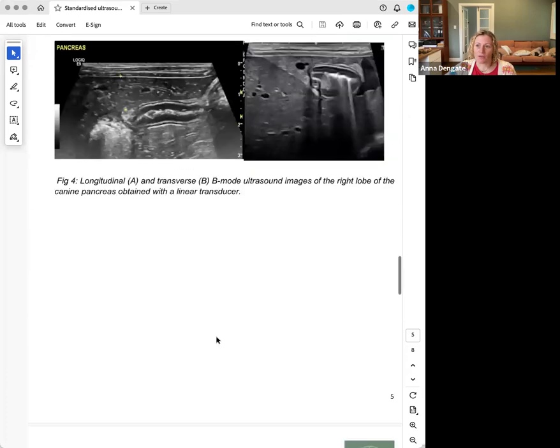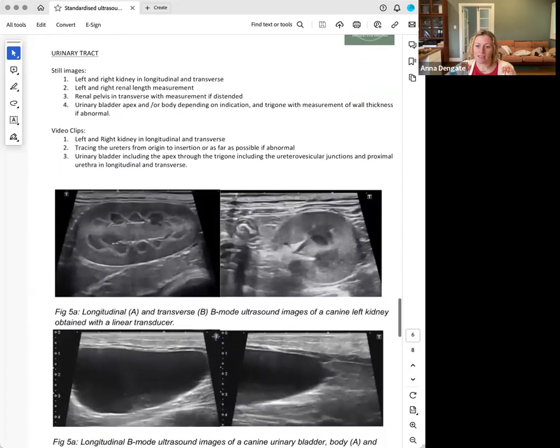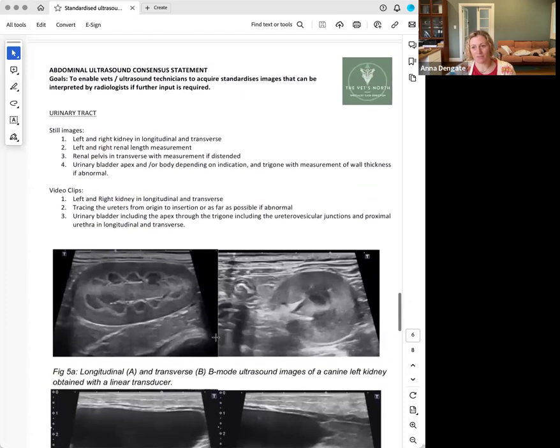So the other thing that I want to really cover is kidneys. 80% of nodules in kidneys are missed with ultrasound in humans. And that's because there's so much going on in the kidneys, right? Like there's so varied echogenicity. There's often little shadows and stuff like that.